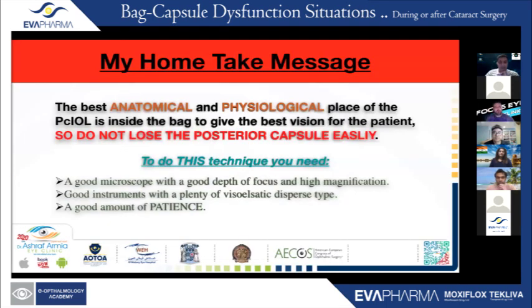So my take-home message is that the best anatomical and physiological place for a posterior chamber IOL is inside the bag, to give the best vision for the patient. So do not lose your posterior capsule easily. To do this technique, you need a good microscope with a good depth of focus and high magnification, good instruments with plenty of dispersive viscoelastic, and a good amount of patience.